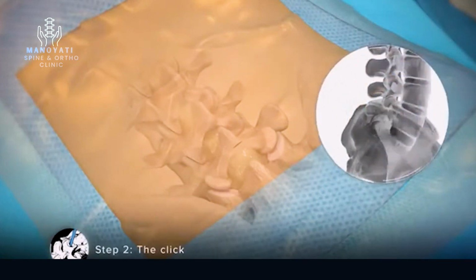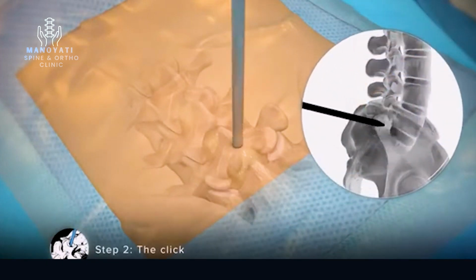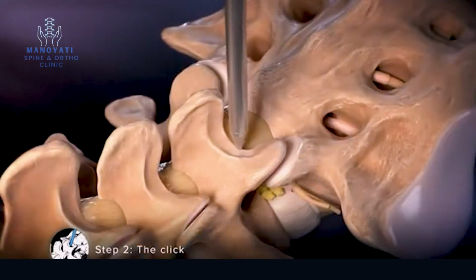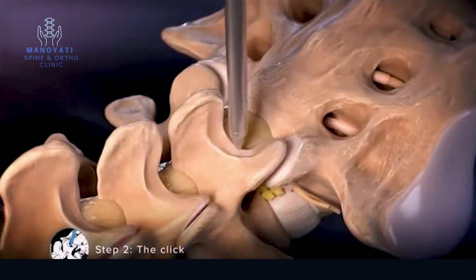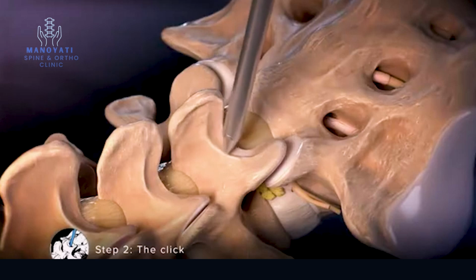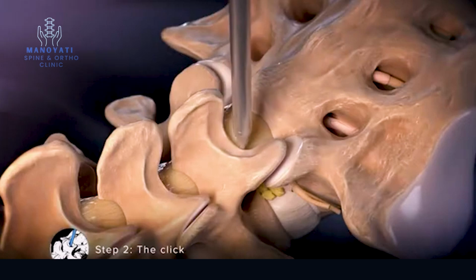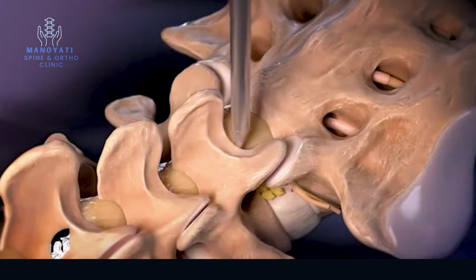Step 2. The click. Use fluoroscopy and insert the switching stick into the interlaminar window and on top of the ligamentum flavum. The tip of the switching stick is used to traverse the inferior edge of the lamina in a caudal to cranial direction. This action should create a tactile click as the tip of the switching stick comes over the edge of the lamina.